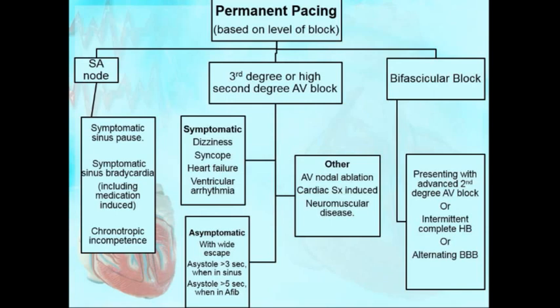When you are working, if you guys go out and moonlight in the ER, that's another thing to recognize. You are so much focused on ST elevation MI, you forget to look at the complete heart block. That one we got just before, literally before getting the arterial stick, our needle moved to get the venous stick, to get a temporary pacemaker just by looking at that one. So you have to recognize that.